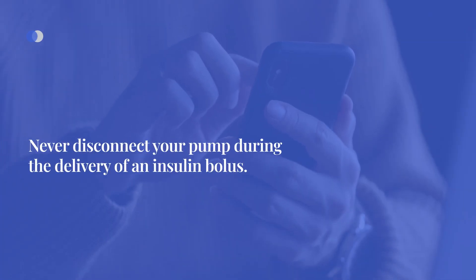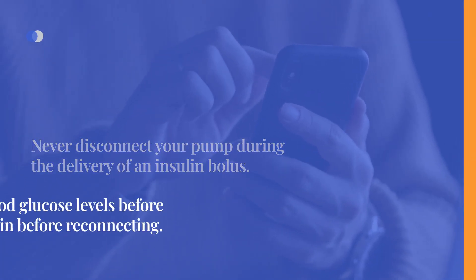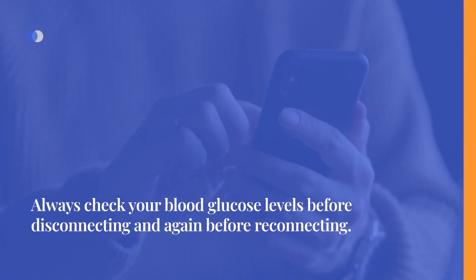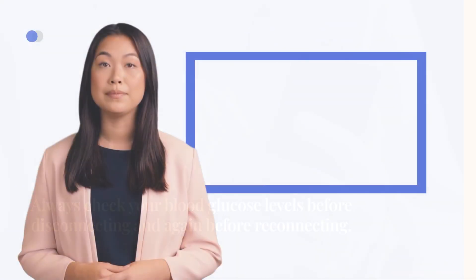Never disconnect your pump during the delivery of an insulin bolus and always check your blood glucose levels before disconnecting and again before reconnecting. If you lose any accessories or need replacements, you can contact Tandem Customer Technical Support.